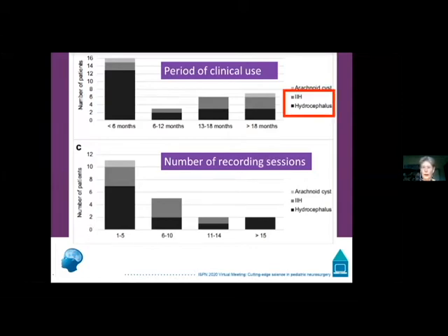Our main indications were hydrocephalus, shunt adjustments, diagnostics, shunt replacements, questions about shunt function, and IIH, which is in keeping with a recent review looking at the currently published papers on telemetric ICP monitoring.